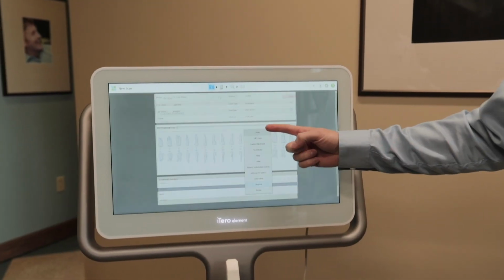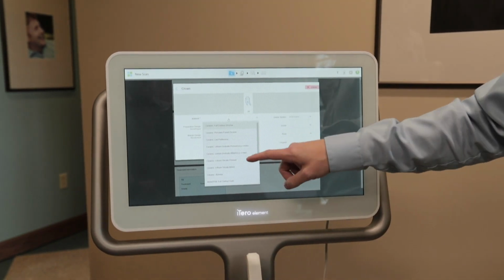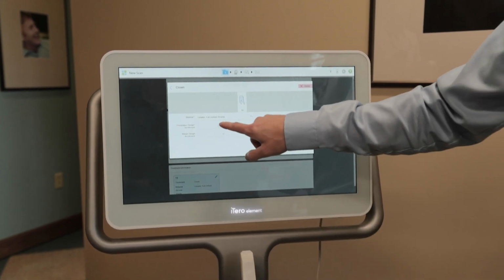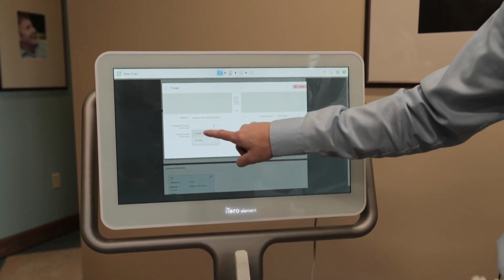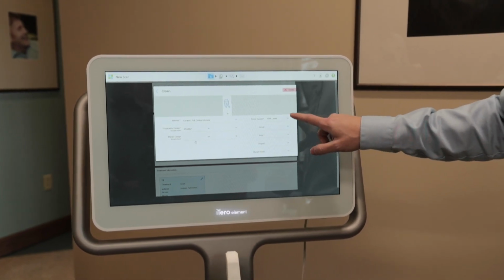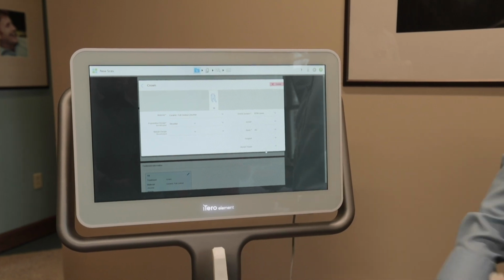We're gonna select crown. You do have all different options on there. All right, we're gonna select our material, posterior. For the most part, we see a lot of doctors just going with full contour zirconia. We're gonna select our prep design, so we'll say that this is a shoulder, and then our shade. We have several different shade systems, but I'm gonna go ahead and say this is an A3.